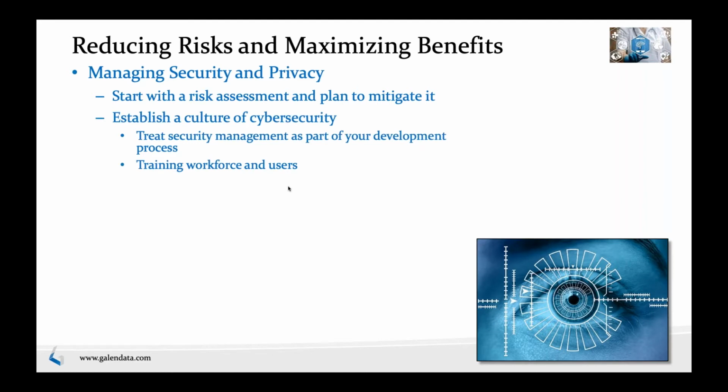The next thing you do is establish a culture of cybersecurity. This is super important. A lot of companies treat cybersecurity as an add-on. They build the devices, they build the solutions, and say, oh, now you have to worry about security. That's the wrong approach. You need to make sure that cybersecurity is part of your company culture, your development culture. You treat your security management practices as part of your development process, just like you deal with anything else. Just like you have functional requirements, you have security requirements upfront. Just like you would do functional testing, you do cybersecurity testing. You do secure coding, working through that entire development process keeping security in mind.